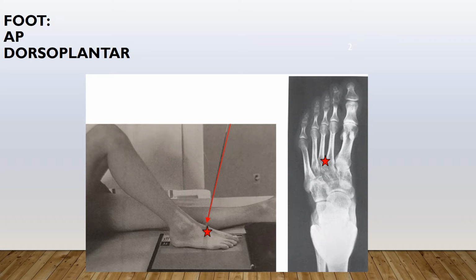Now, if I have a situation where the patient is toed in or toed out, I want to make sure that the foot I'm x-raying is straight, and then they just place their other foot so they feel that they are in a normal standing position. And it will show if the foot is going to be a little bit supinated or pronated. So if you have a podiatrist, please try this position and it will work well for you.